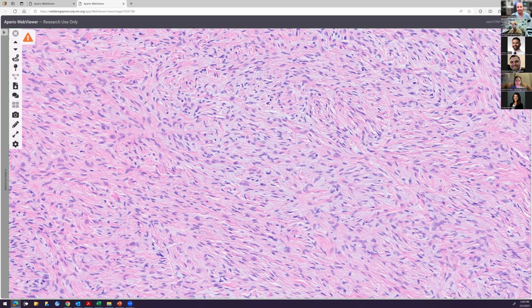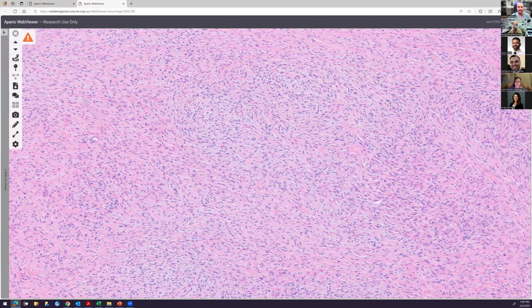Those, to be honest, are extremely rare, and you basically never see them. So I would not worry too much about them. Out of all the low-grade fibromyxoids, it's probably like 1 in 50 that I've had with hyalinizing collagen rosettes. They're not very common, to be honest, so it's really just not that great a marker.